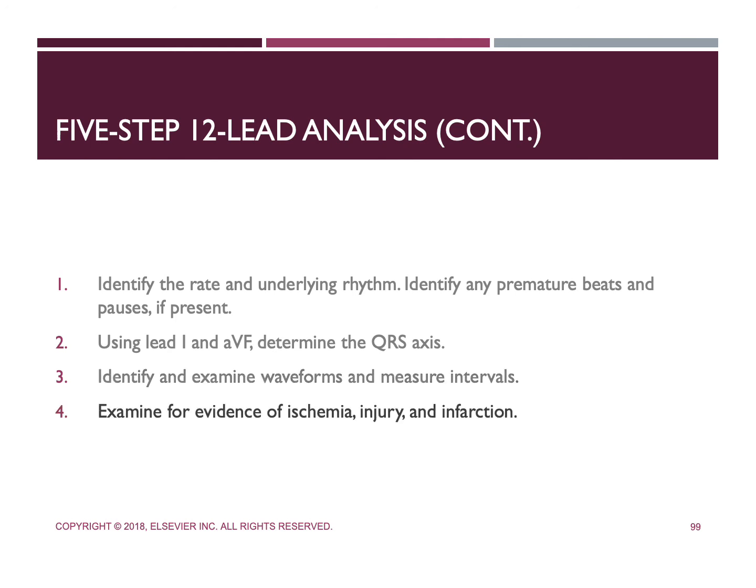In step 4, we're going to examine for evidence of ischemia, injury, or infarction. "I see all leads" is a commonly used mnemonic to recall the lead groupings when we're localizing an infarction and when we're predicting which coronary artery is involved.